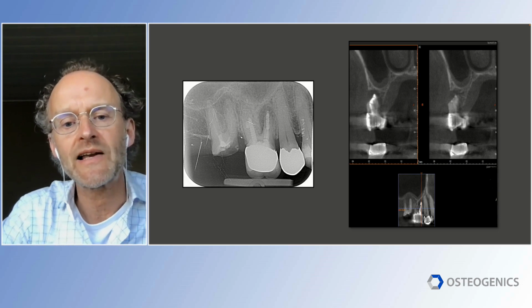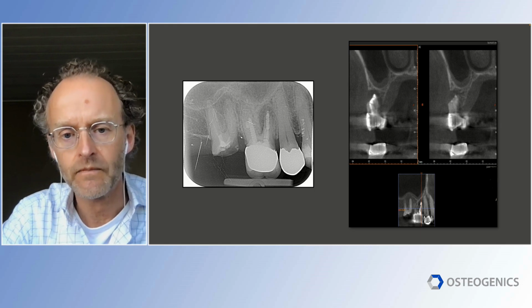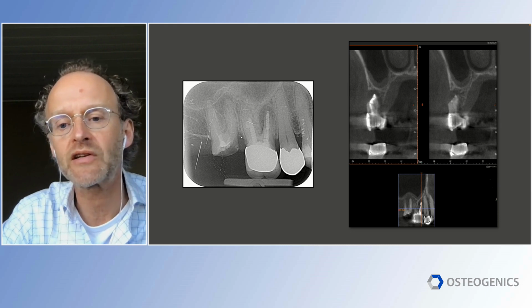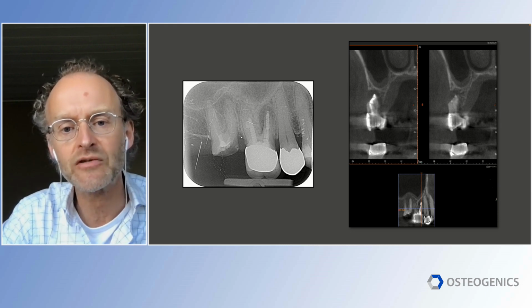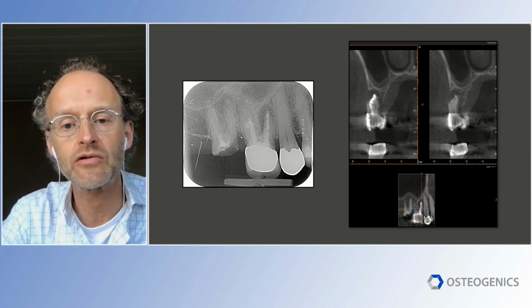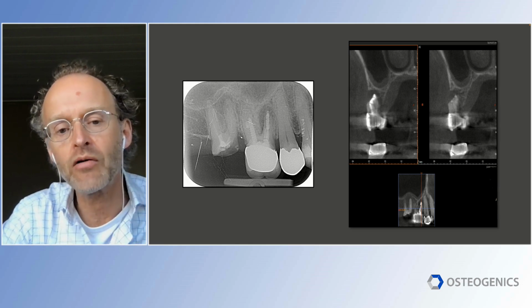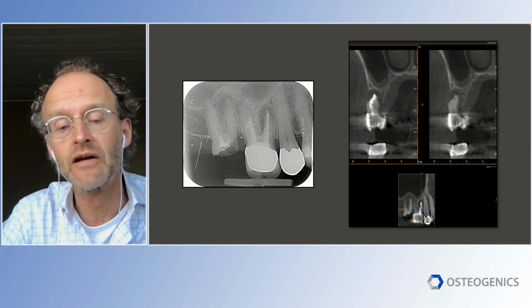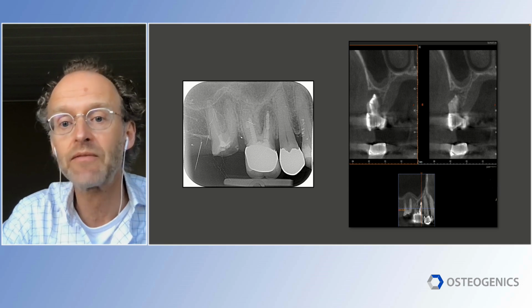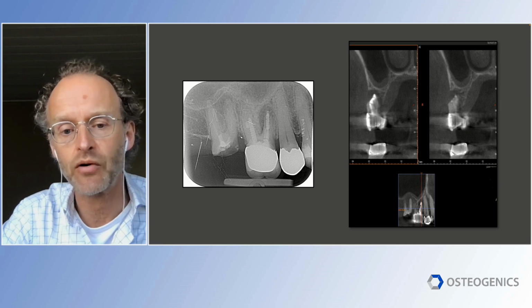For example, a patient like this. I treated this patient more than a decade ago. Two molars which have to be extracted. The first molar, the patient wanted an implant. On the right of your screen, you see the cone beam details and you see a lot of bone loss due to apical surgery. So we decided to extract both molars. In the first molar, we applied a bone graft and also a titanium reinforced d-PTFE membrane because we wanted to have as much support as possible. In the second molar, we only placed a collagen sponge.